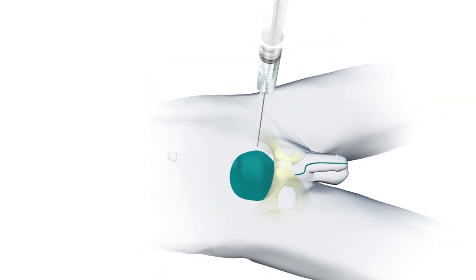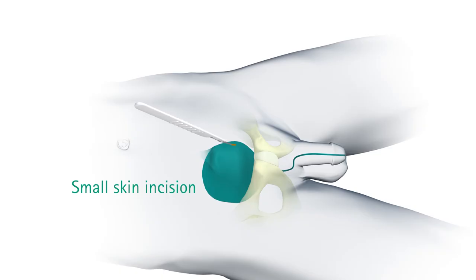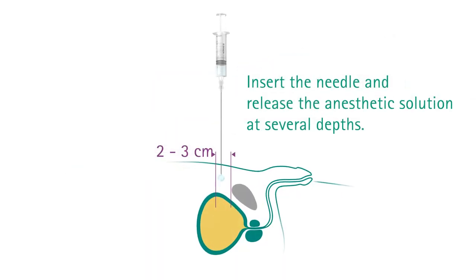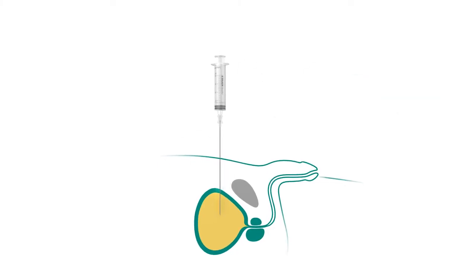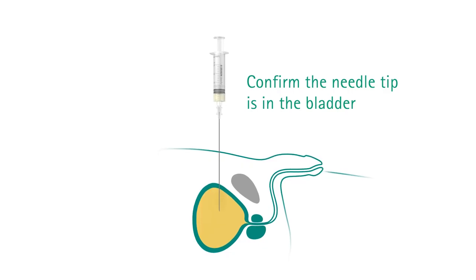At the start of the procedure, you can anesthetize the targeted area with the needle and the previously prepared syringe. Then make a small incision in the skin on the target area. Insert the needle and release the anesthetic solution at several depths. When the needle is well in the bladder, check the position by aspirating some urine.